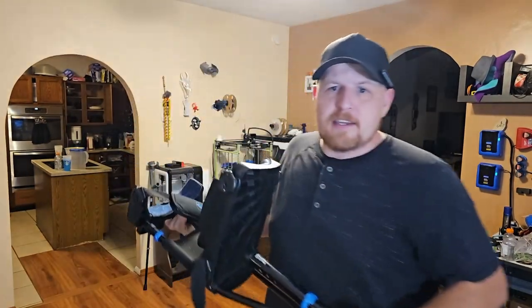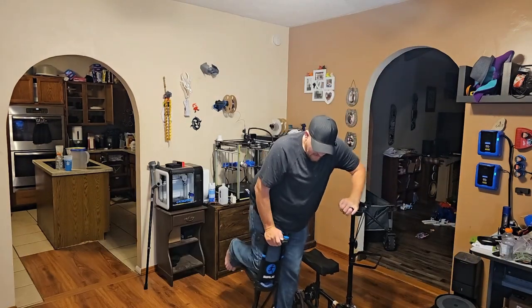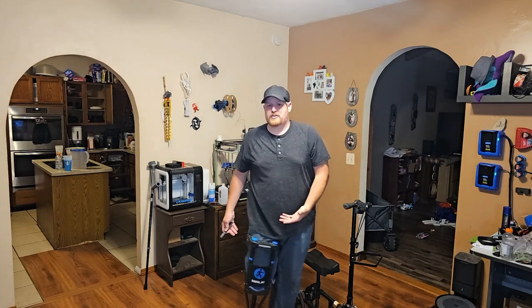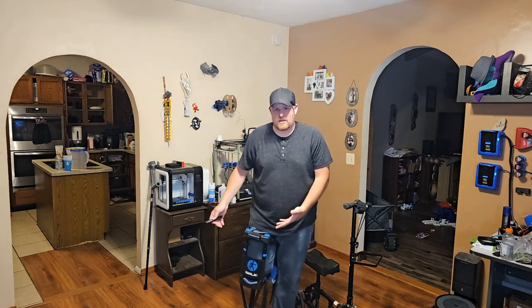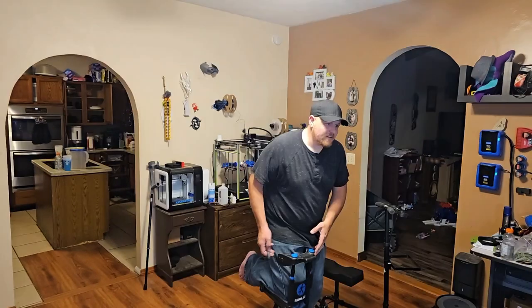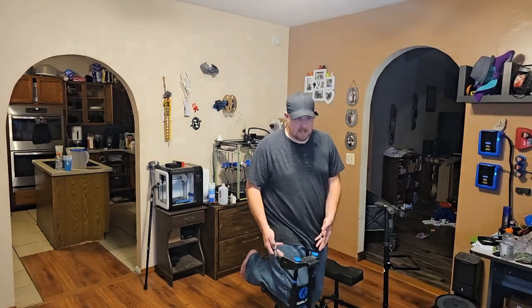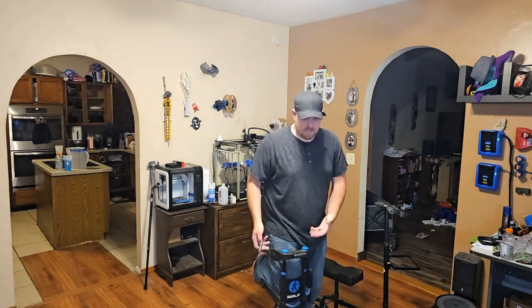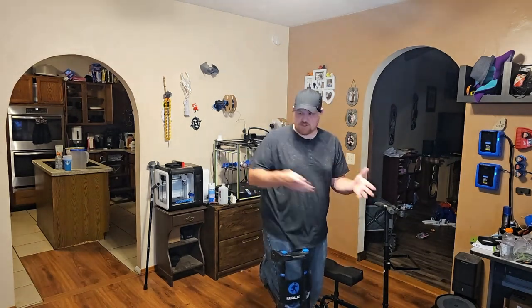I still recommend that you also have this cart. Because although the iWalk is awesome, you have to get up out of the chair, put your knee in it, and then put on all the straps just to go somewhere. If you're planning on doing a bunch of things, that's fine — you'll be wearing it for a while. But if you're just getting up for a second, having to strap it on and off every time you want to move from the couch to the kitchen is a pain in the butt.